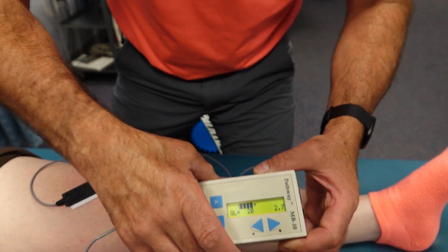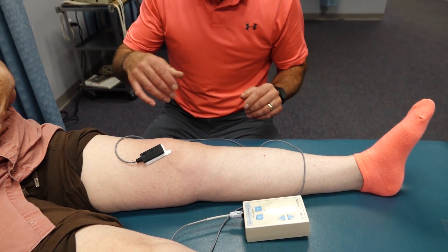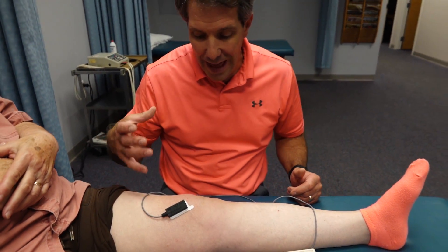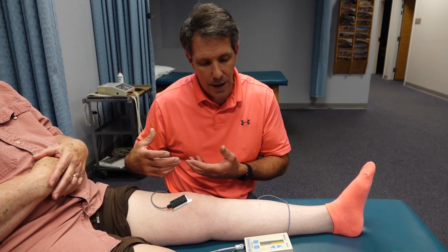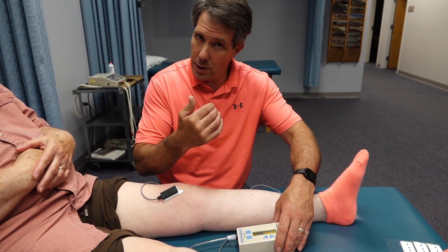So we're going to back off now a little bit. A while ago she was not contracting that hard, but now she is because she understands she can hear that her quad is working a little bit better. And we can change that arrow and move it and change the goal so she can work a little bit harder.